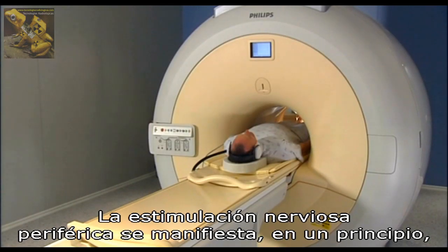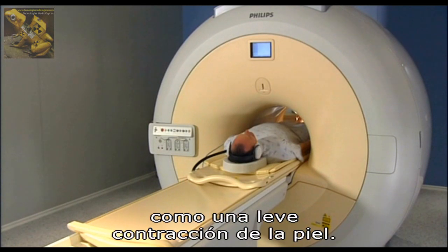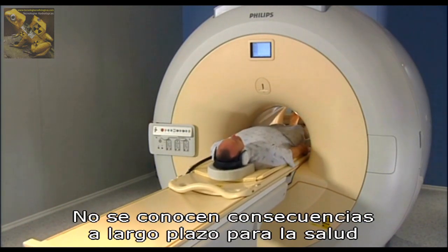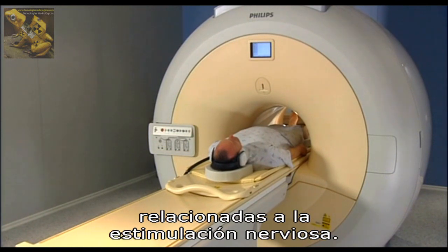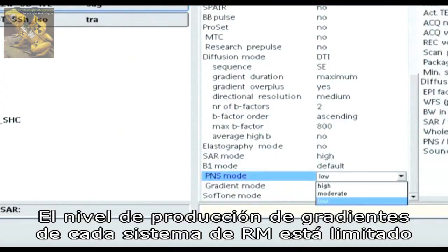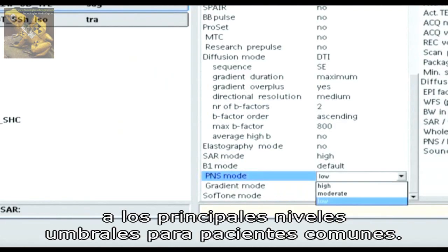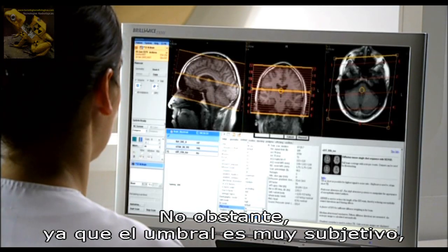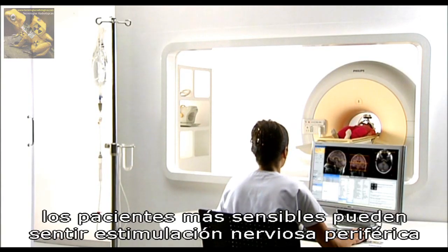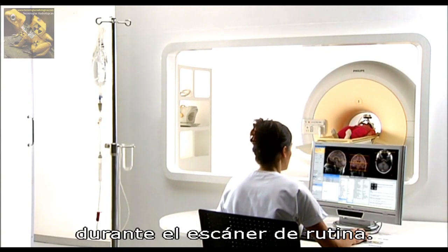Peripheral nerve stimulation is first observed as a slight contraction of the skin. This can vary considerably in position over the body and is very subjective. There is no known long-term health effect related to the nerve stimulation. The gradient output level of every MR system is automatically limited to values of the mean threshold level for patients. However, since this threshold level is very subjective, sensitive patients may feel some peripheral nerve stimulation during routine scanning.